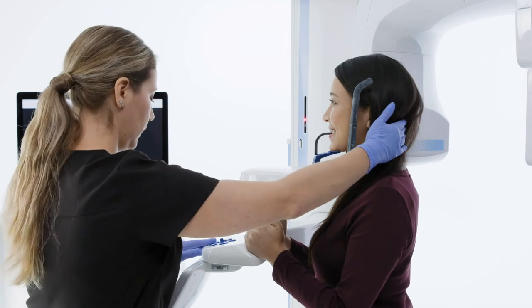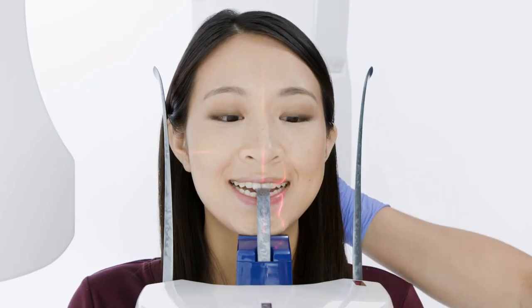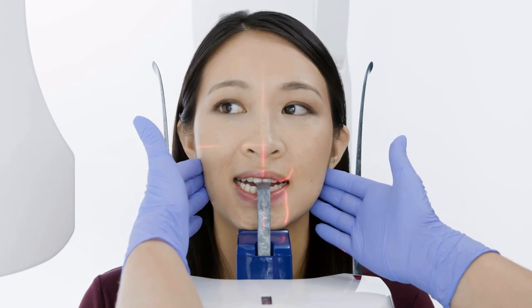Use cotton rolls to open occlusion if needed. Lower the bite stick so the patient's chin is resting on the chin rest. Verify the cervical spine is stretched by gently lifting up on the back of the patient's head.